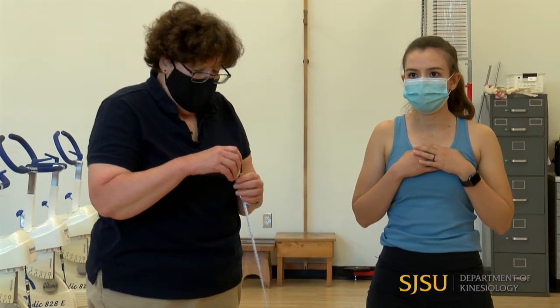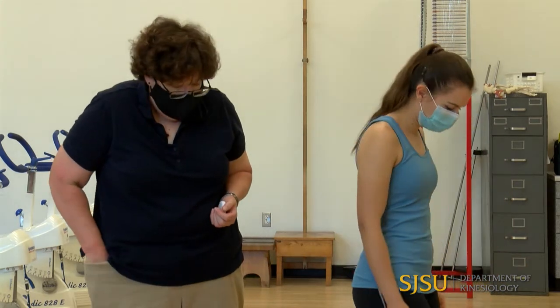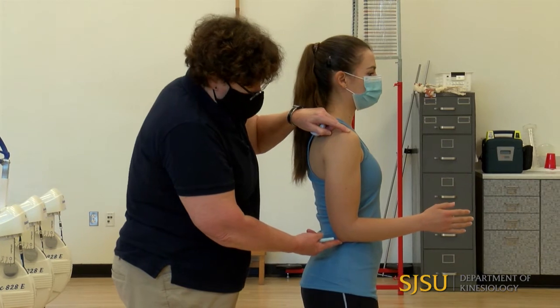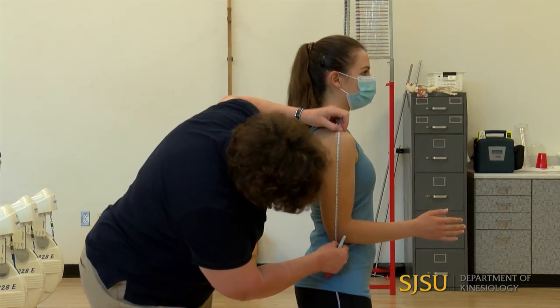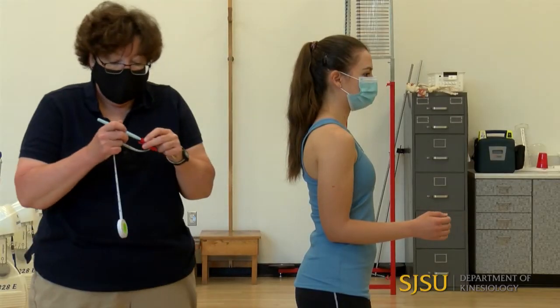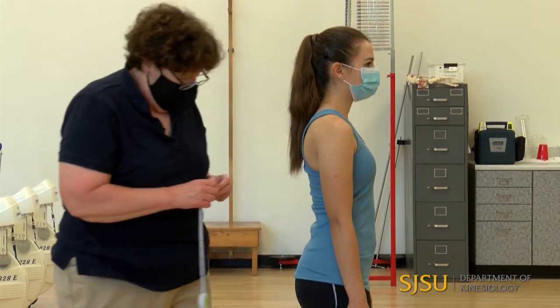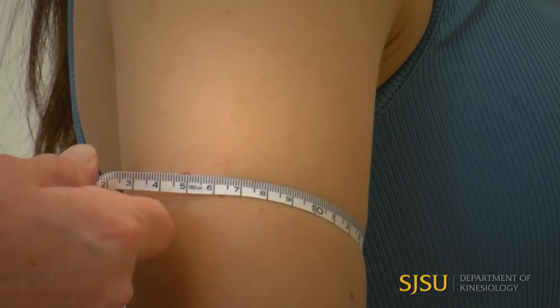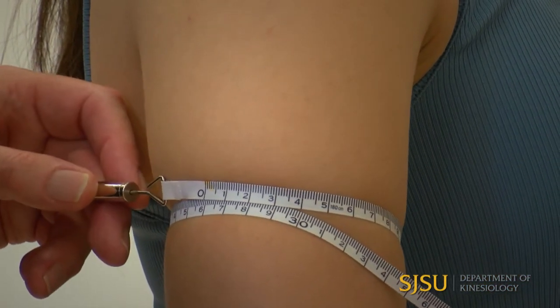We have two more measurements on the upper limb: biceps and then the forearm. For the biceps measurement, we need to go midway from the acromion process to the olecranon process of the ulna, so I palpate those two points and measure on the side of the arm. I get 36 centimeters, so halfway will be 18 — I put my mark there. We measure on the side because if we have a bulging biceps or triceps, that would impact the measurement, and we want it as linear as possible. Once marked, put the tape measure right over the mark and pull it out to the Gulick handle.